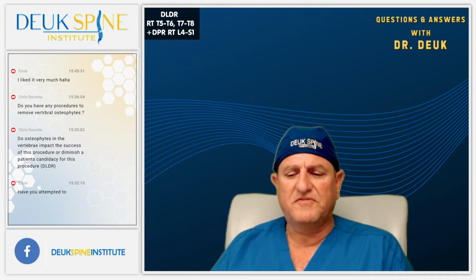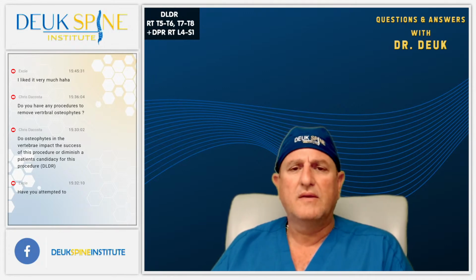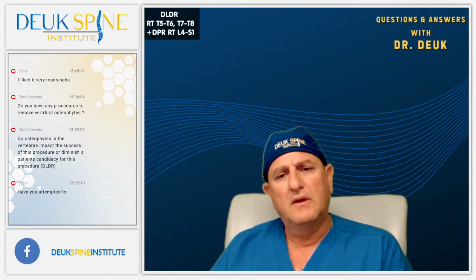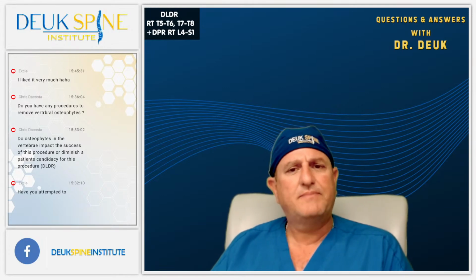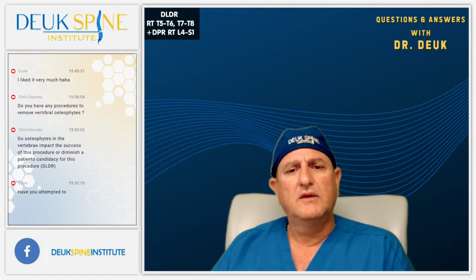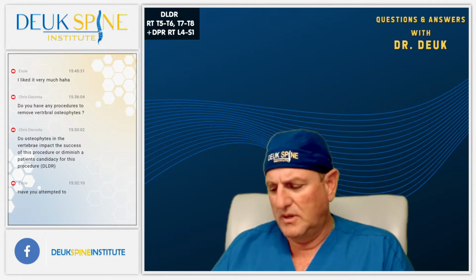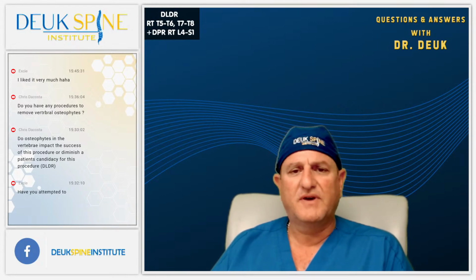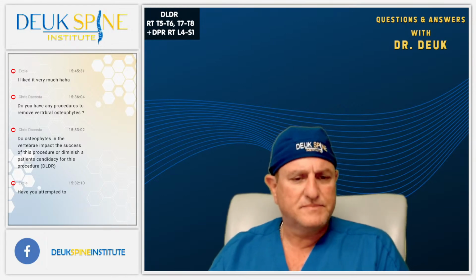And are patients with the osteophytes still candidates? Yes, you are. Absolutely. If there is an osteophyte, and by the way, there was one in this patient, a small one, and I zapped it away with the laser. If you go back and watch it, it was on the left-hand side. It was like a little bony bridge. Long story short, doesn't matter if there's osteophytes, the surgery still does the job.